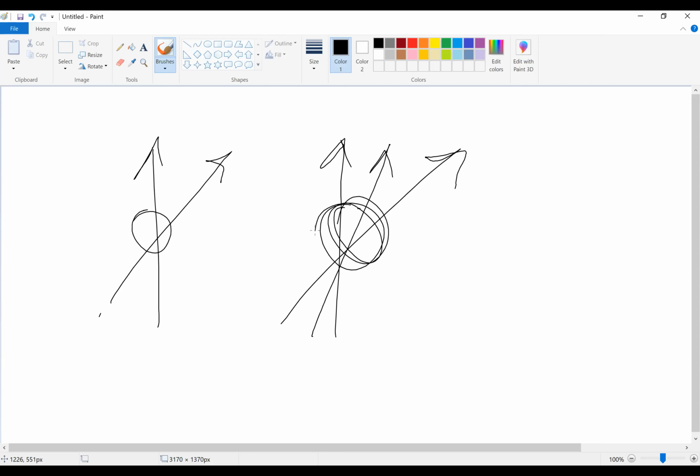This time, which is changing, which happens at this time, there's a loss of some energy, and we can find that energy in a magnet, and we can change it into a signal, which can make an image through something called Fourier transformation. Okay.